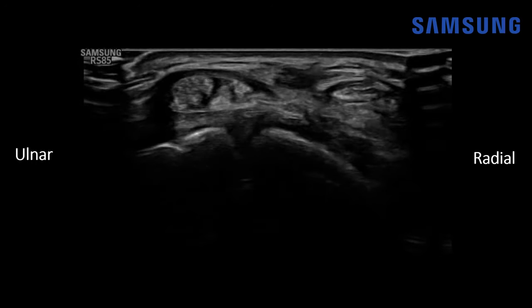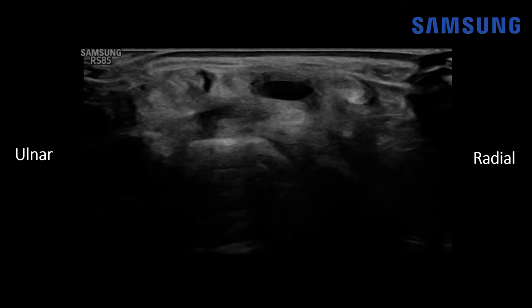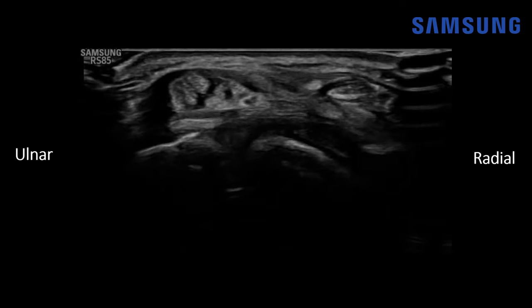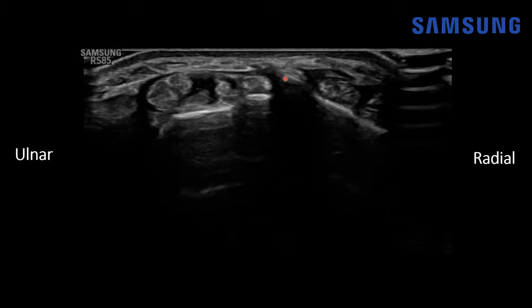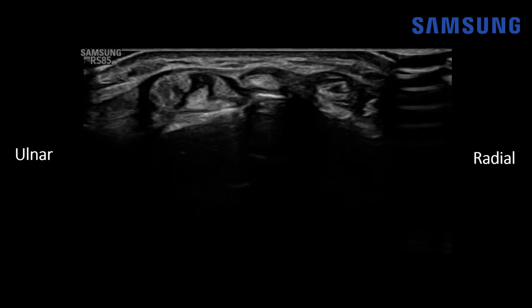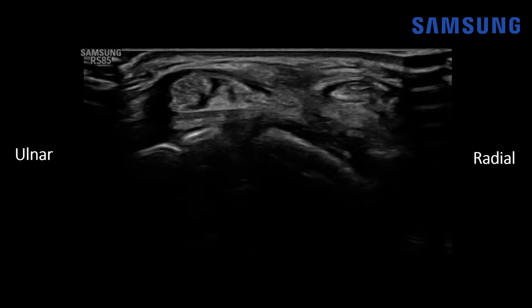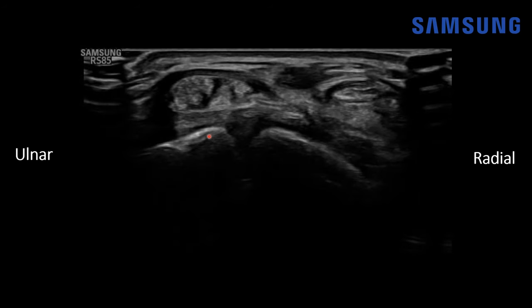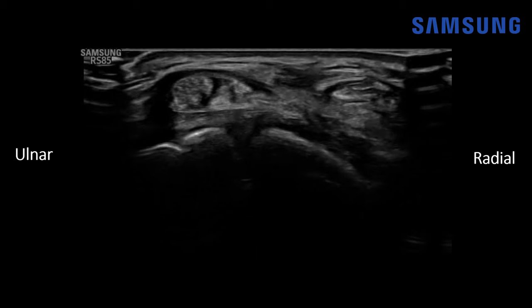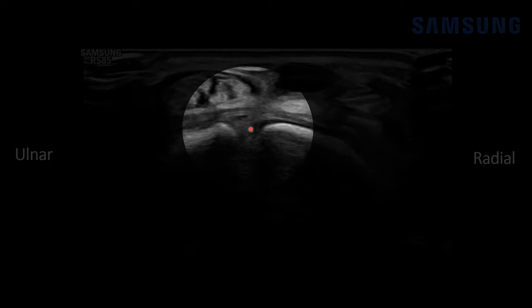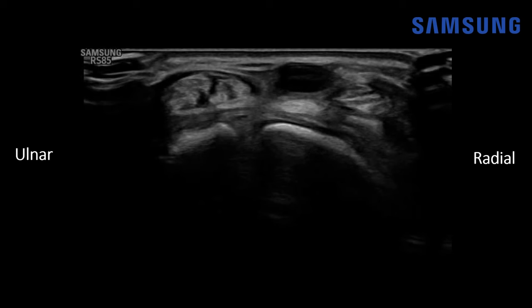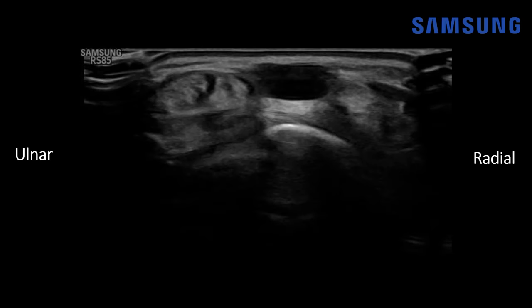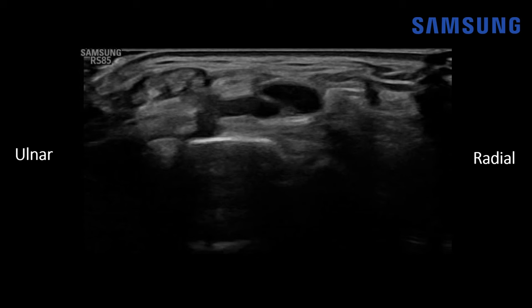Now another important thing to evaluate for dorsal ganglion cyst is the scapholunate ligament. As we move back to Lister's tubercle and then distally, we can see the scaphoid bone come into view. Right adjacent to that is the lunate, so the scapholunate ligament — the dorsal band — will be located right here. You can see a bit of that band; it appears intact. We can also do dynamic maneuvers to further evaluate that. We don't see any fluid there, and this cyst appears to be arising not from the scapholunate ligament, but a bit more distally at the carpal joint.